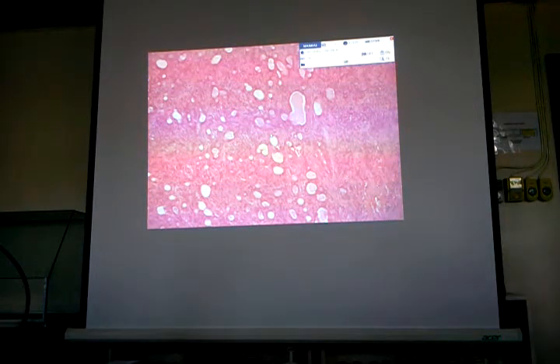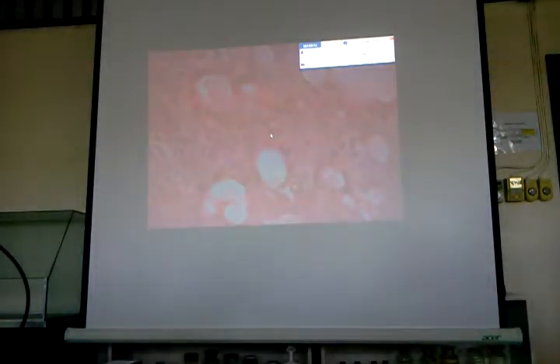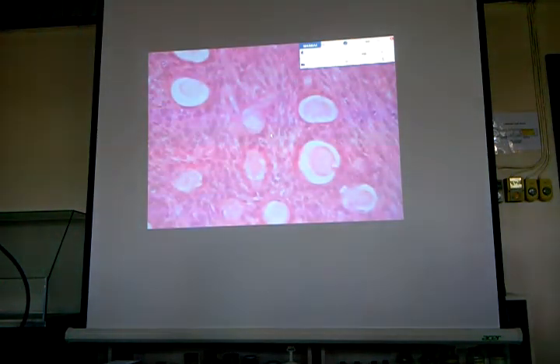Now, this portion of the tumor is showing us another type of histology. So we are seeing lumen of glands. If we zoom in, we will be able to appreciate epithelial cells lining these ductal or tubular structures. Okay? Mayroong spindle-shaped cells coming from the stroma.